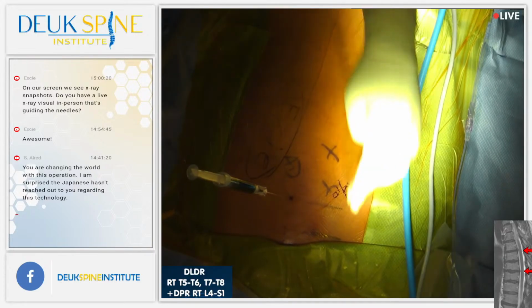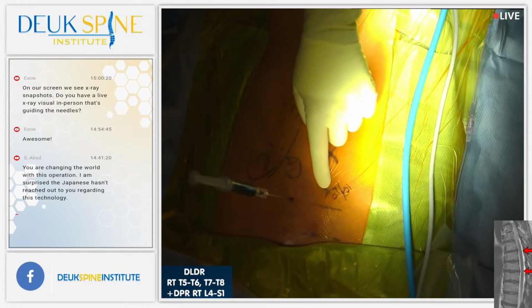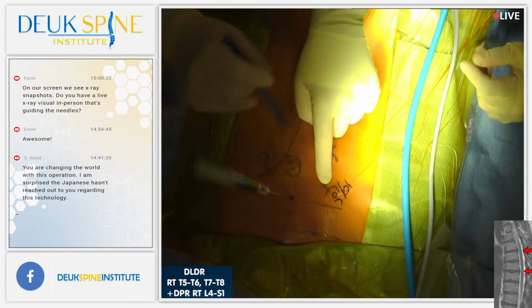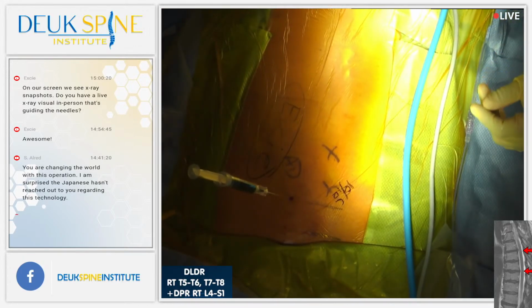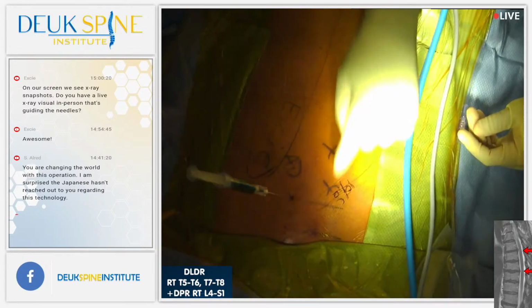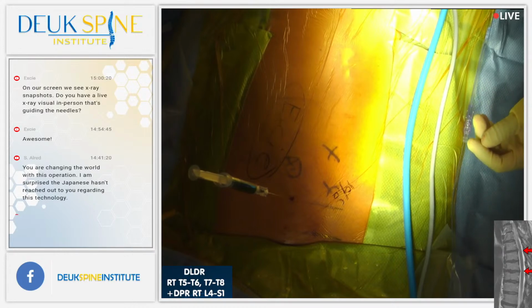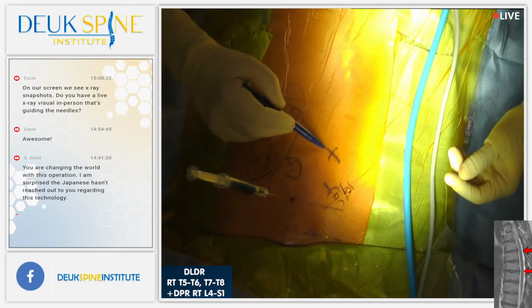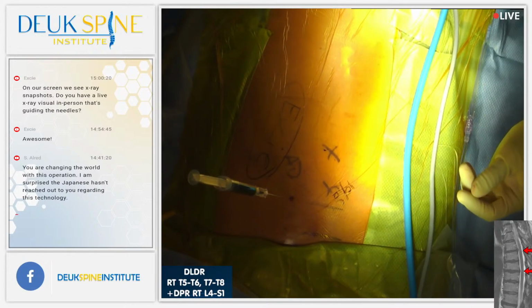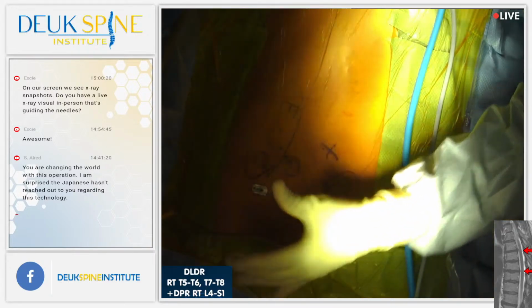So, based on her MRI, she's got a herniation here and here, and the bottom herniation at 7-8 lines up. You can put her to sleep. She's got 10 out of 10 pain there. Now, when we were trying to get into the higher disc at 5-6, I hit this weird bone growth off to the right side, and she's saying she doesn't have a lot of pain up here. Her pain is here and even here, but this is not a disc that we're treating. So we're going to have to go back and look at the MRI again, because she may have another disc that is causing pain that we didn't pick up on the MRI. But definitely this one is causing 10 out of 10 pain, and hopefully this is going to fix that problem for her. So that's what we're expecting.